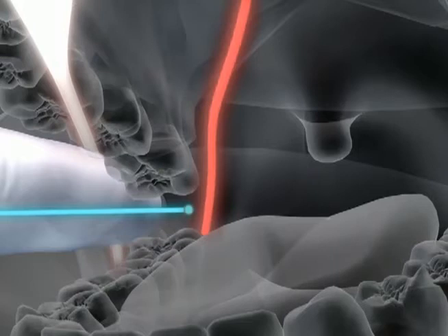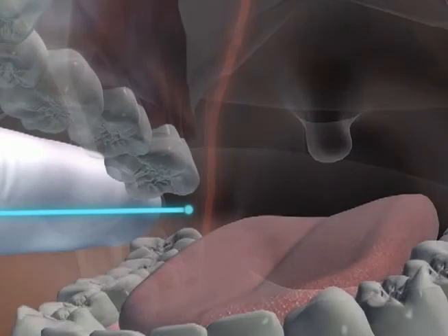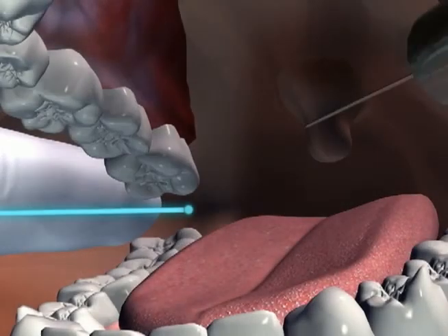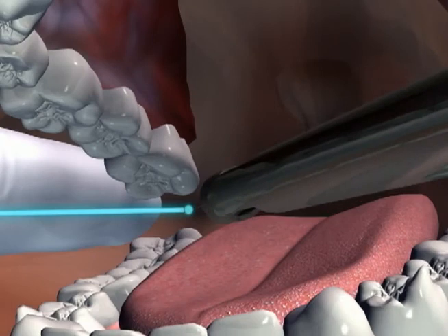Positioning the syringe over the premolar teeth on the opposite side and just above the plane of occlusion, the needle is placed at the insertion point within the depression, about 1/4 to 1/2 the distance from the raphe to the finger.